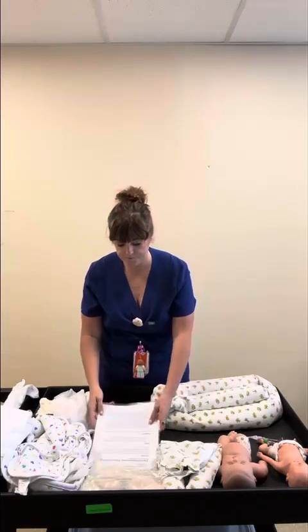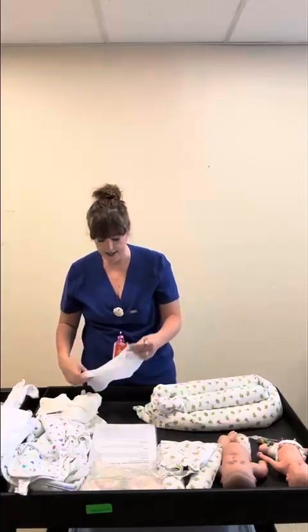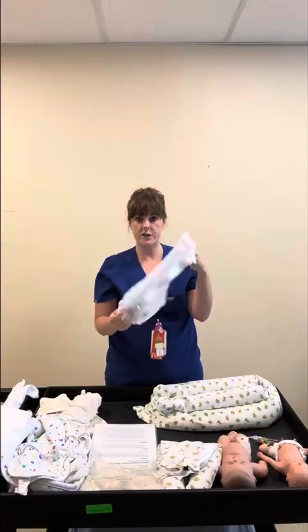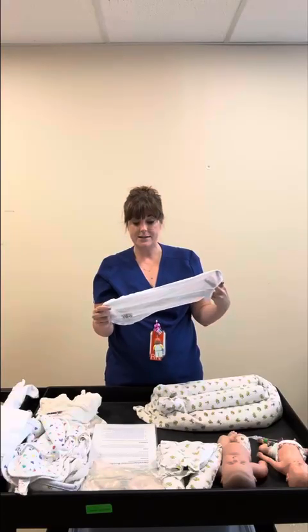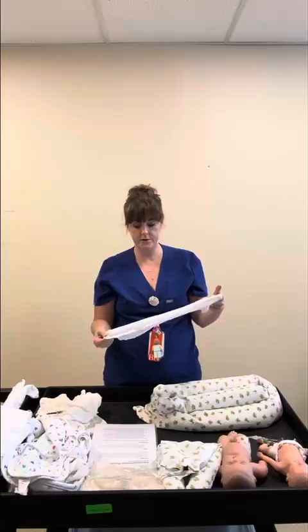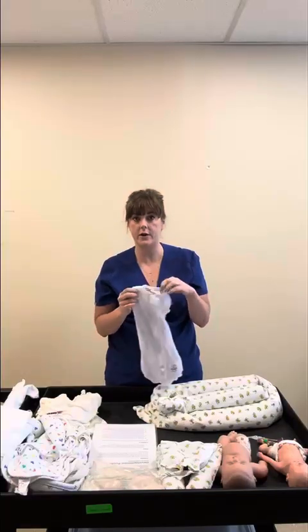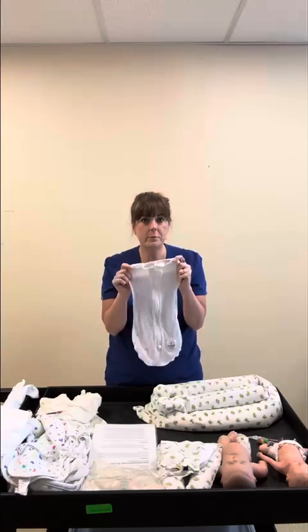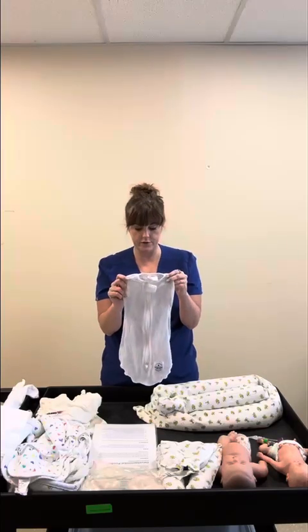So the next scenario is to position this baby supine while in phototherapy. This baby is really tiny. We have 3 sizes of this, a tinier one and a bigger one. This is called a Wombi pod. It is kind of like a little baby straitjacket that's mesh and has like 96% lucency. So most of that phototherapy light is getting to the baby. If you find that your providers are asking you to take them out of this because they're not getting enough light, you can assure them that they're only missing out on like 3 to 4% of those rays.